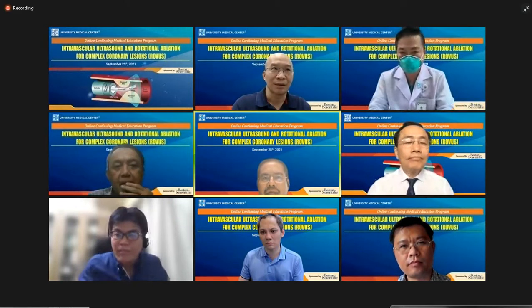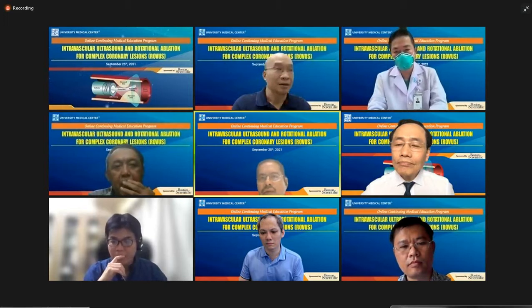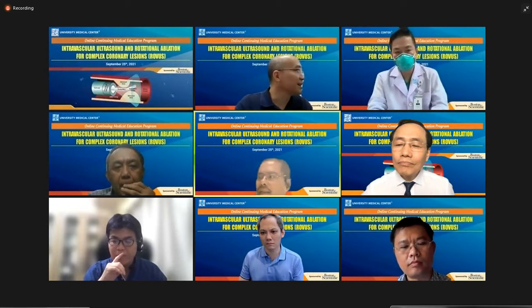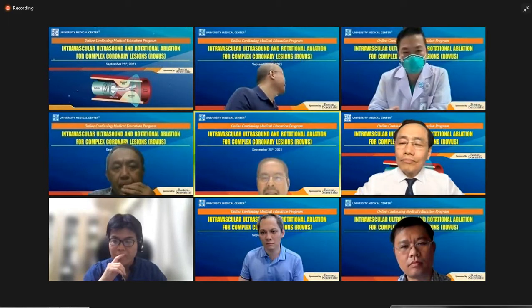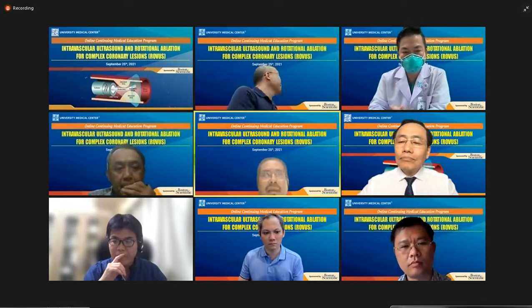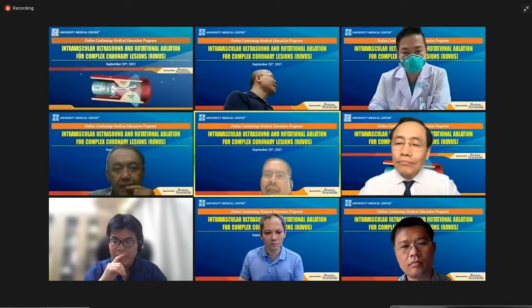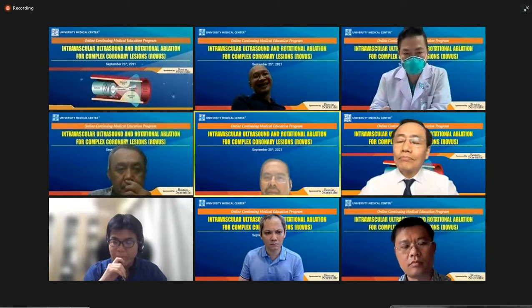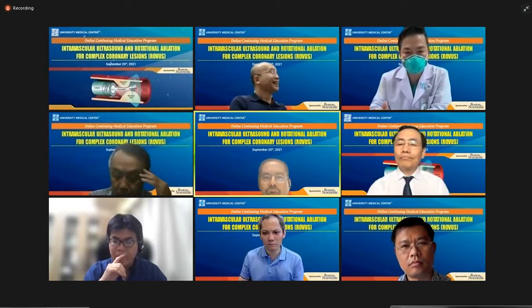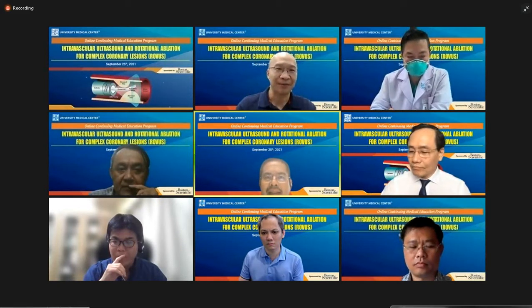Is there any situation where the prediction is not correlated with the real scenario? For example, you predict that the side branch is not occluded, but after you put in a stent, the side branch is occluded. What is the main reason for a failure case like that?